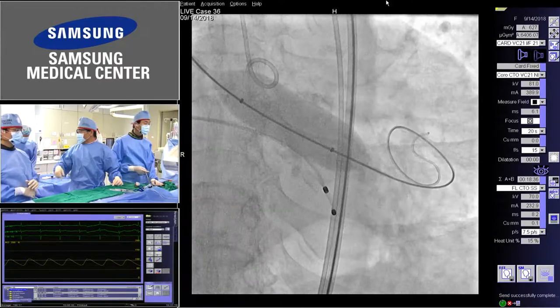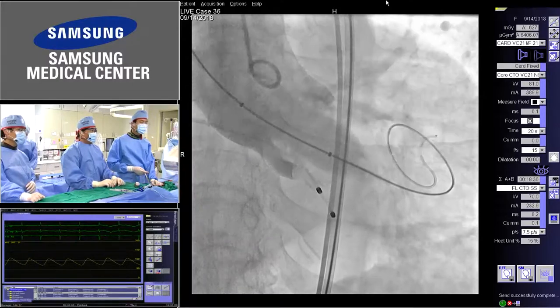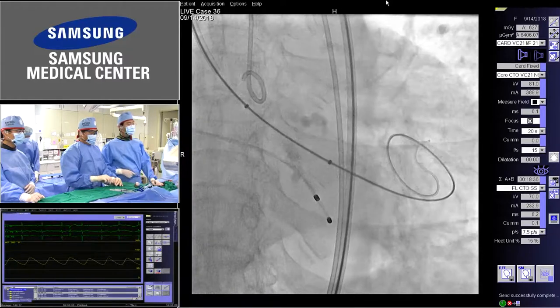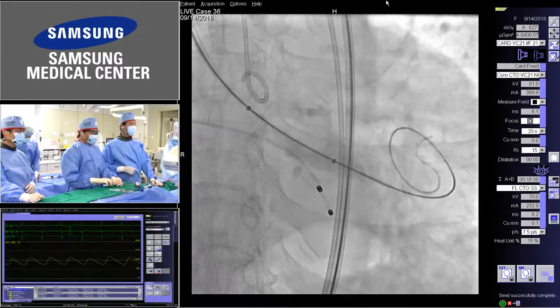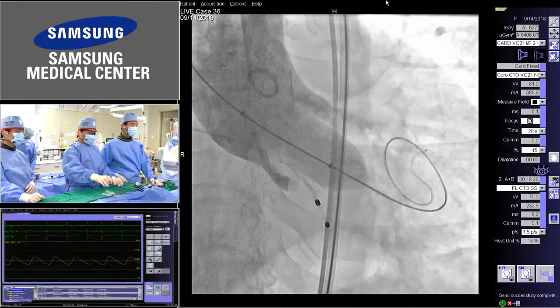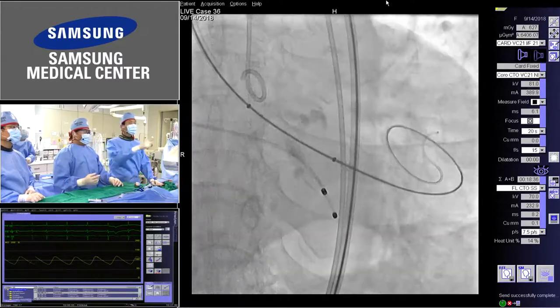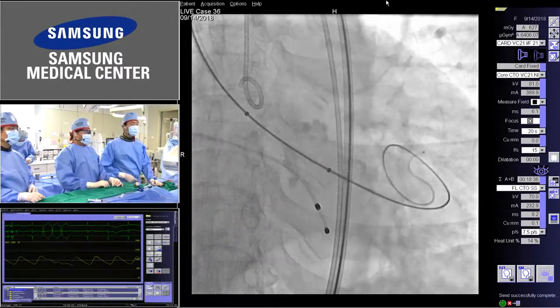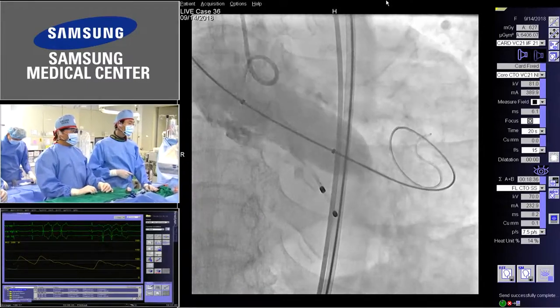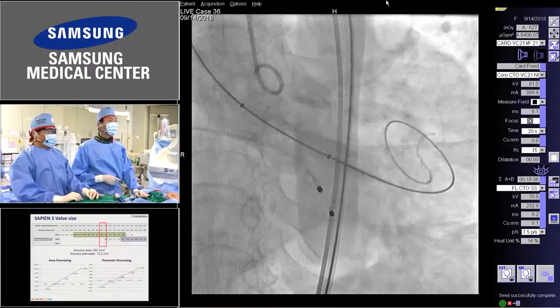So what's your recommendation? This is a 20 balloon, and we selected the 23 valve. So do you recommend underfill? What size? 23 valve. This is a 20 balloon, Sapien valve 23. The problem with the 23 is, and I'm not an extensive Sapien user, but the opening area of the 23 is just borderline.